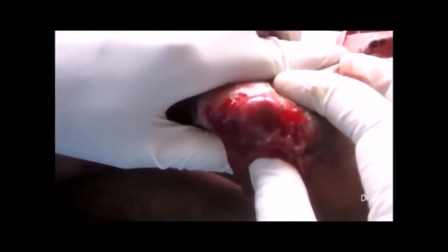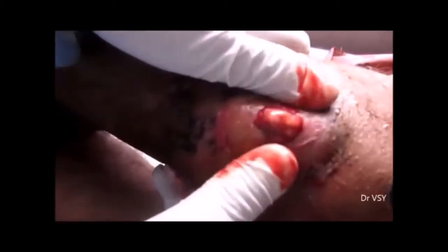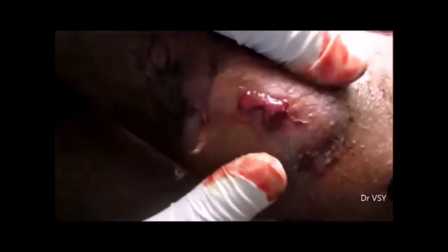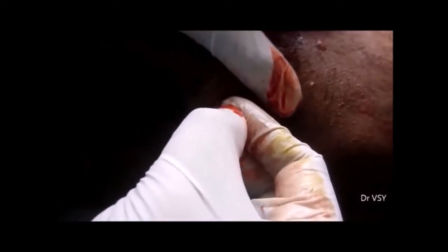You can see the pus coming out of the cavity — the pus is oozing out. A lot of pus was present. The loculations were broken with the index finger. The incision was small, so the size of the incision was increased, and the loculations were broken so that no pus remains entrapped.